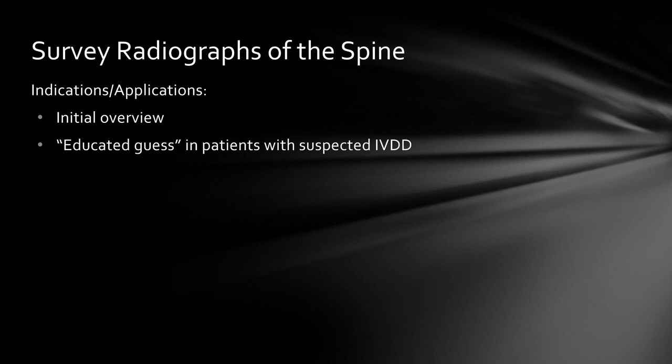On many well-positioned survey radiographs, at least with extrusions, you can actually give a fairly accurate assessment what side is the most clinically significant one. Of course, you still need to follow it up. We also, at least in the past, used to take a lot of survey radiographs of the spine prior to deciding if we wanted to go to CT next or MR, just based on if we were seeing mineralized discs or not. Today, honestly, we skip that step, and in many cases with acute myelopathies, go to CT as the first-line imaging test.